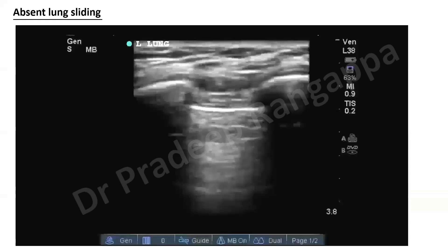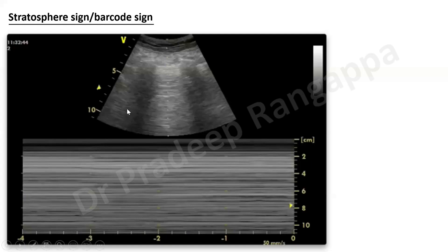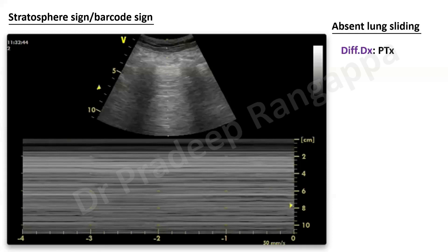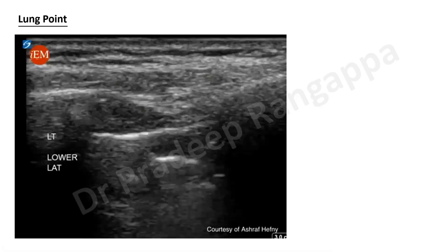When there is absent lung sliding, if you're unsure whether sliding is present, put M-mode. You'll get something called the stratosphere sign or barcode sign. Unlike the seashore sign, there is no differential between sea and shore — everything looks uniform, with horizontal lines throughout. This is called the barcode sign or stratosphere sign, indicating pneumothorax. The differential for absent lung sliding includes pneumothorax, atelectasis, pleural adhesions, apnea, or phrenic nerve palsy — but the typical garden-variety presentation is a large pneumothorax.